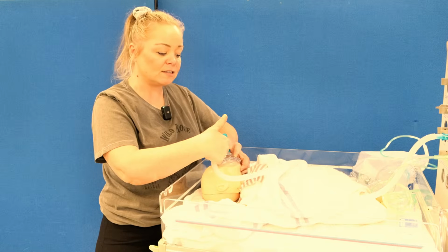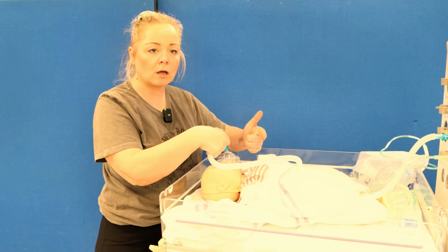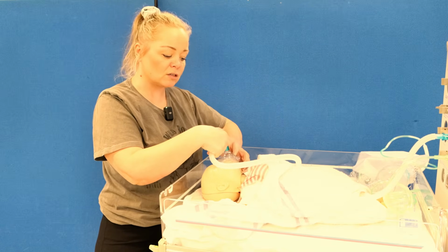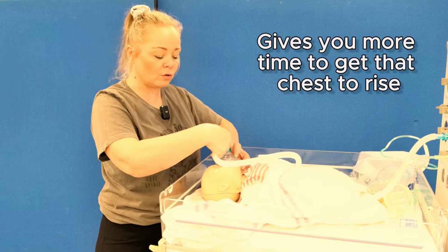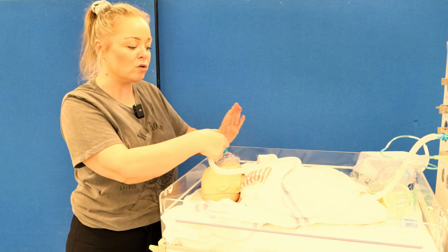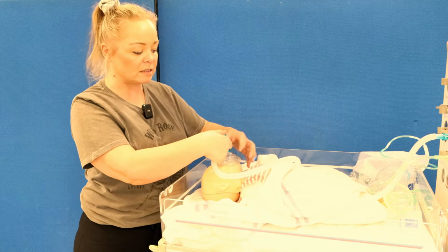Because it's really easy to say 1, 2, 3, 2, 2, 3, 3, 2, 3, 4, 2, 3. If you're saying 1 slow breath, it gives you more time to slow it down. It gives you more ample time to get that chest to rise. If we're going too quick, we're not going to push that fluid out, like I mentioned, to be able to move on to those ventilations.